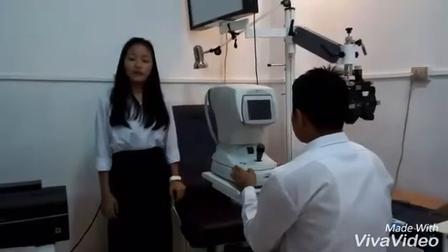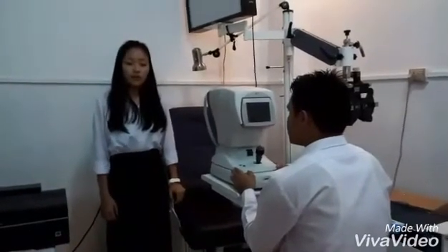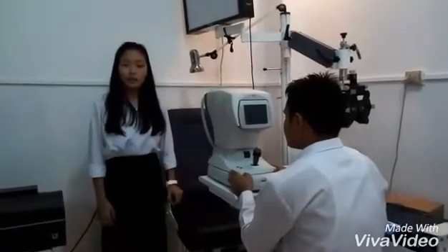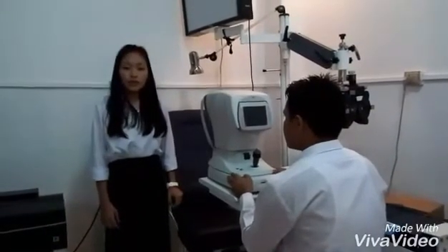Today we will be doing the procedures of our refractometry. Before going into the procedure, we must make sure that the patient is instructed well about how the procedure should be carried out.